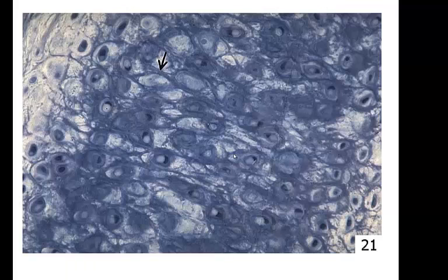This reminds me, now we've moved on to elastic cartilage. Elastic cartilage is only found in two places in your body. Elastic starts with an E, and the two places that you find it in your body also start with an E. E for ears, E for epiglottis. So that's kind of an easy one to remember. E epiglottis, E ears, E elastic.